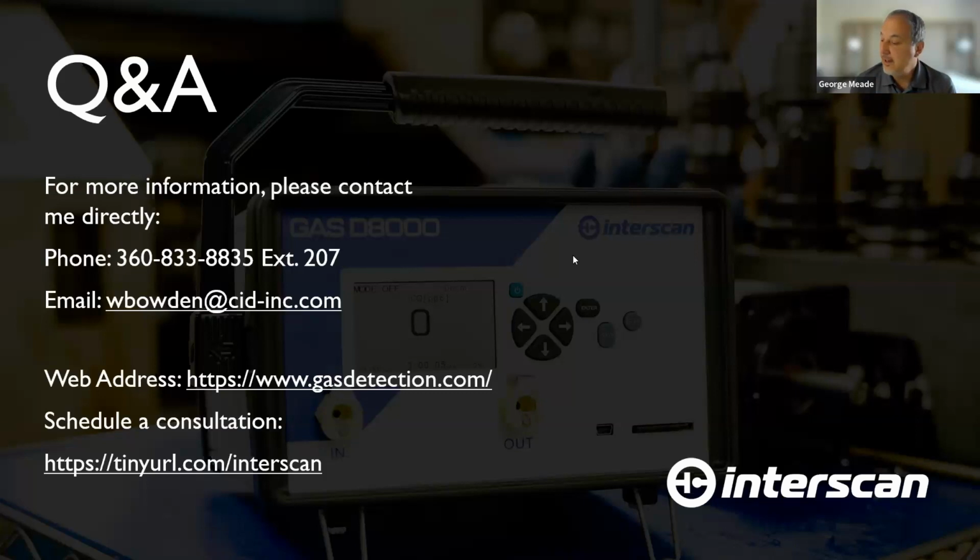Yeah, Will, that's basically the same issue that we have in SPD as well. Again, I hate to keep beating the drum here, but that's why it's so important to have people who are trained properly, so that if an alarm does go off, they know how to react and the questions to ask themselves, because the most common interfering vapor, of course, is alcohol.